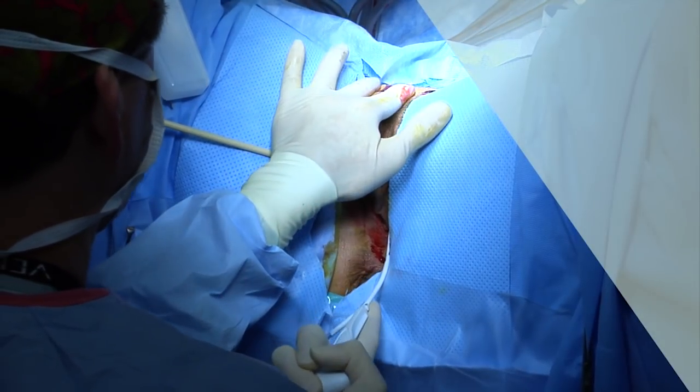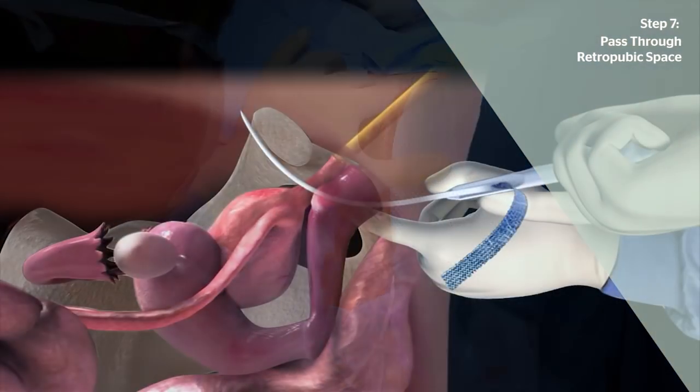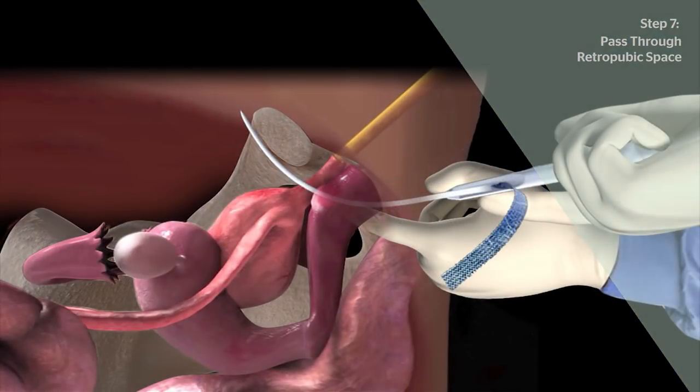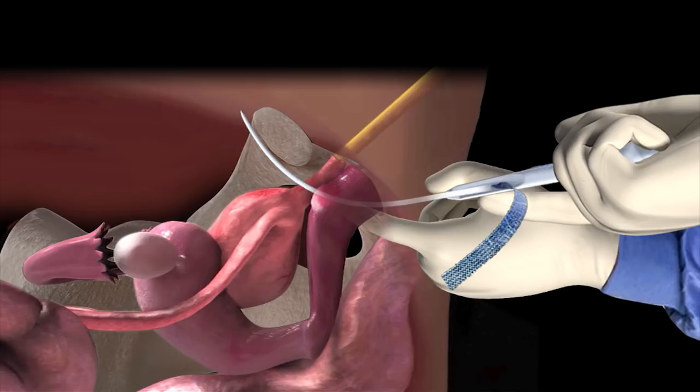Now move the non-dominant hand from the vagina to the suprapubic exit site. Continue to keep the handle low while aiming the trocar sheath tip towards the pre-marked abdominal exit sites and advance the trocar sheath tip through the retropubic space.